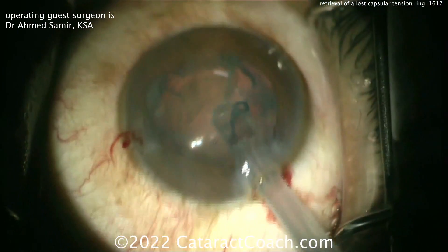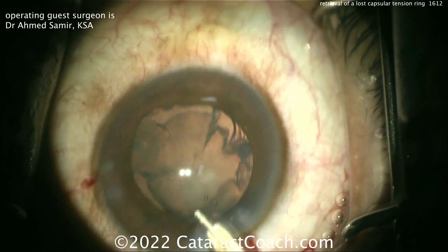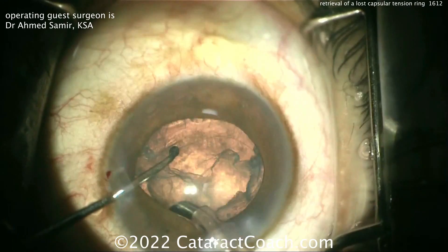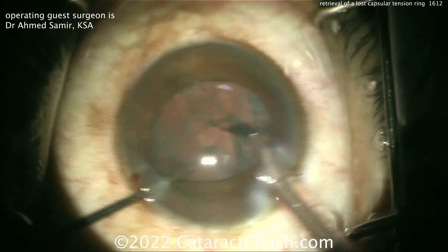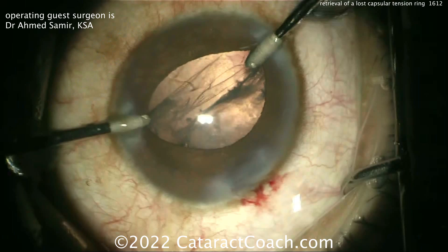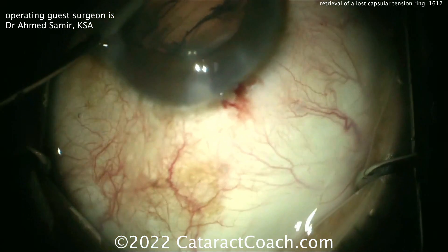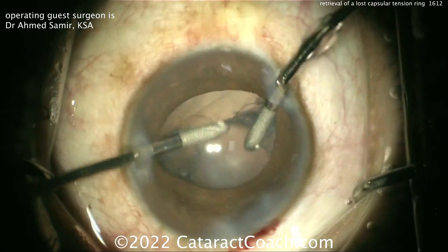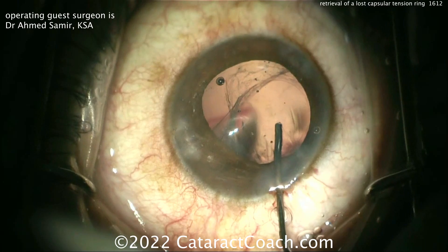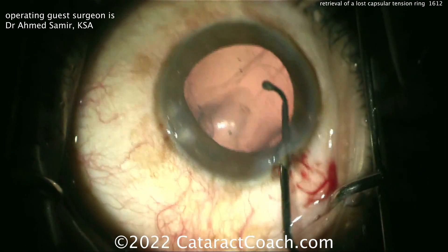Every time I see that clear red reflex, it makes my heart skip a beat. A capsular tension ring goes inside the eye — you think it's pretty good, right? But did the CTR go in the capsular bag, or did the CTR end up in the sulcus? That's the question. Watch carefully — removal of the rest of the cataract. Look at that, the dialysis is still there. How do you have zonular support that's gone with the CTR in the eye? That must mean the CTR is not in the capsular bag. I like the technique here — manual cortex removal with the IA probe, filling up the capsular bag and pushing that equator back out. Now you've got probably six clock hours of zonular loss — a lot. But where's the CTR?